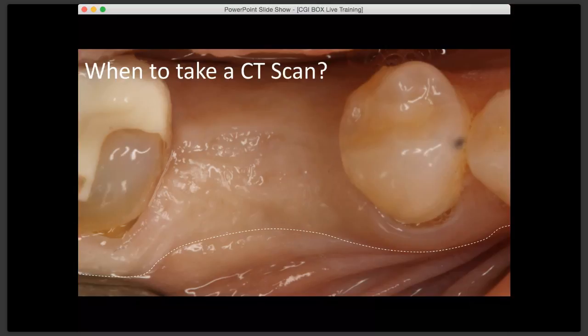What you'll find out if you try to be the hero and overbulk and overgraft is that this bone needs to be vascularized. Anthony's laughing. This bone needs to be vascularized, so it has the potential to get infected if it's not. So be very careful in regards to how much bone you're sticking in there.